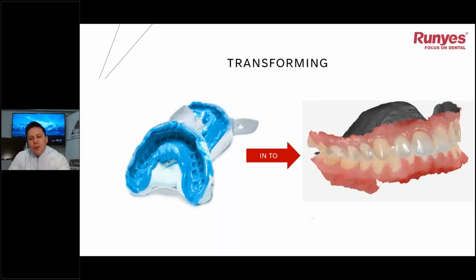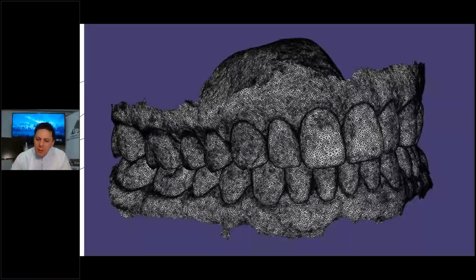So we can transform this analogic impression of silicone into this. And that happens with all those images put together.